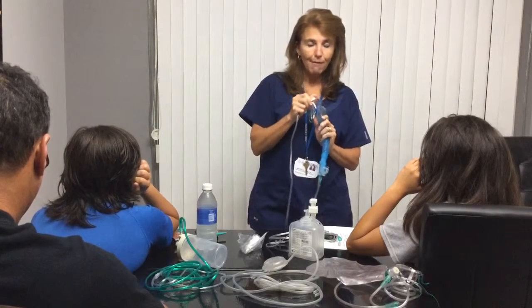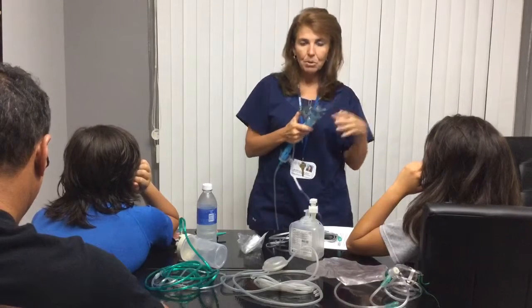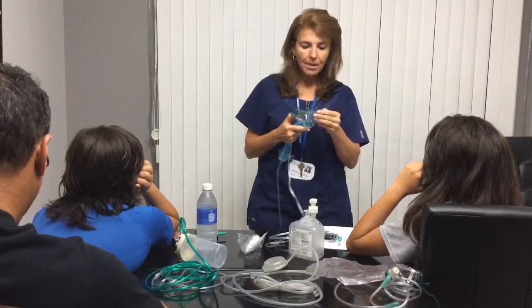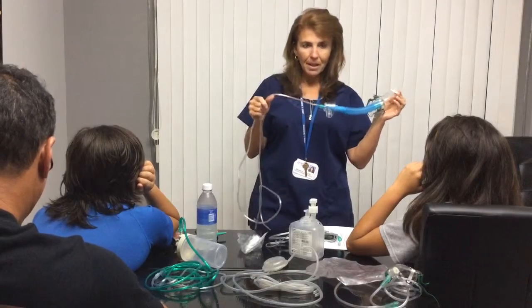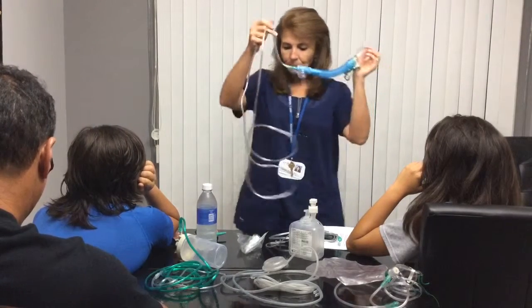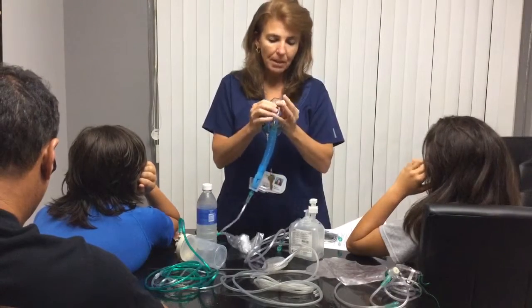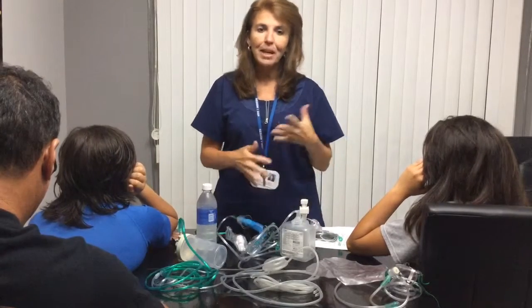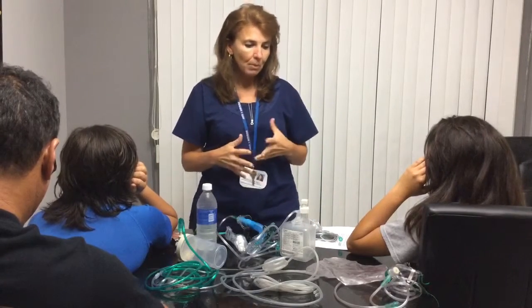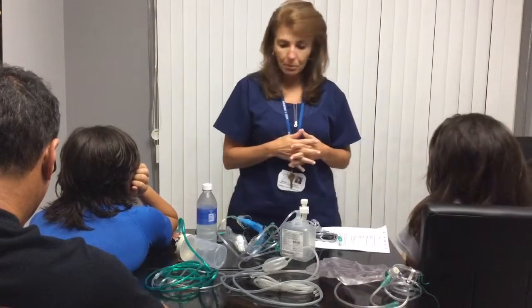Most masks require 5 to 6 liters to flush out your exhaled CO2. So we don't want retention under the mask, so therefore we'd want to ensure that this is the only mask that has that exception. This mask is typically used for COPD patients. Once you've passed that 50% range and the patient is becoming a little more unstable, you want to go to either a high flow cannula or short of a non-rebreather, which will give you 100%.